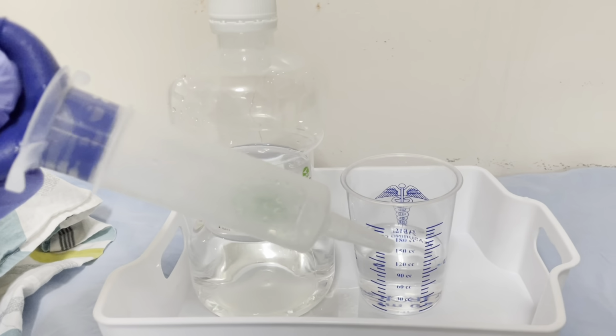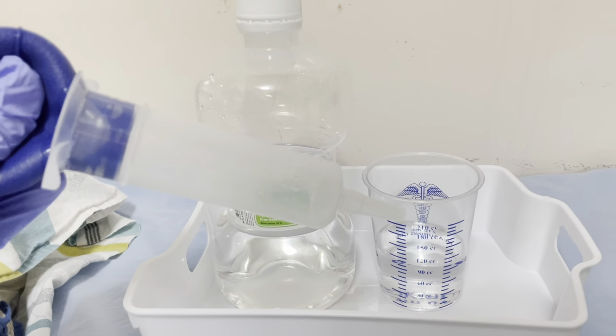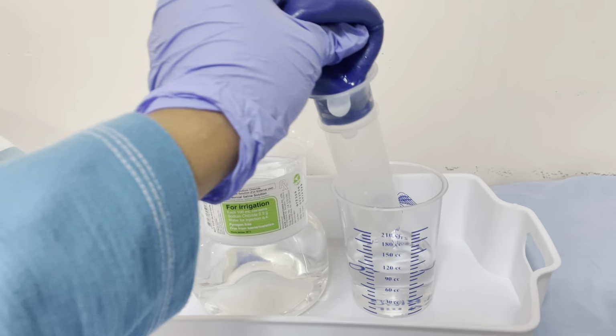So now we can proceed with the filling of this asepto syringe with the solution.